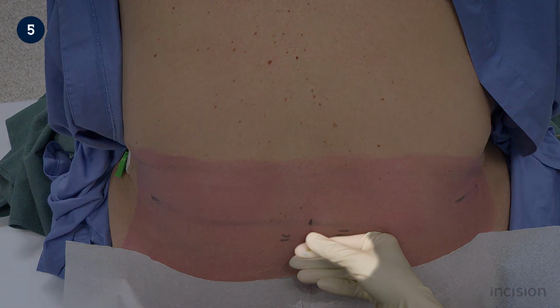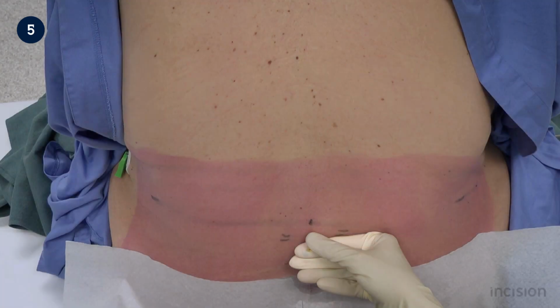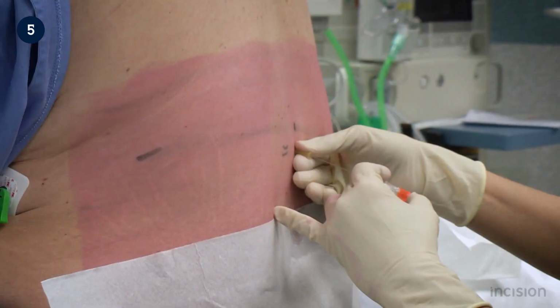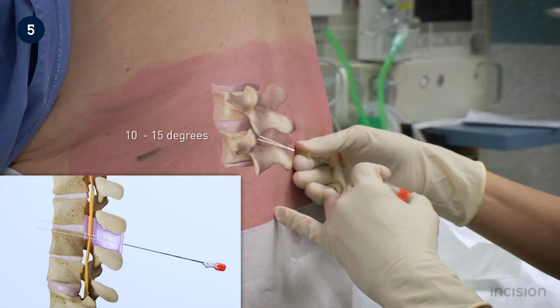The thumb and index finger are used to grasp the hub of the needle introducer. The backs of the index and middle finger are braced against the patient's back to provide stability, while the dominant hand is used to pick up the needle and advance it, as can now be seen. Take note of the angle at which the needle is advanced. At 10 to 15 degrees, it approximates the direction of the spinous processes, improving the procedure's chance of success.